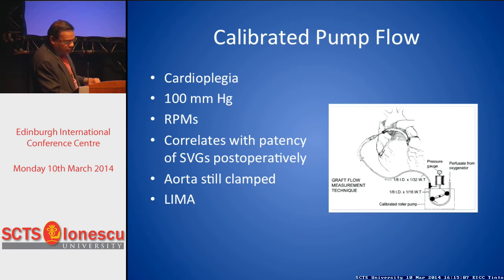The advantage of this technique is that it is done while the cross clamp is still on. So if there's a problem with the graft, you can correct it. The disadvantage, of course, is that it cannot be used for pedicle grafts like the left internal mammary artery.